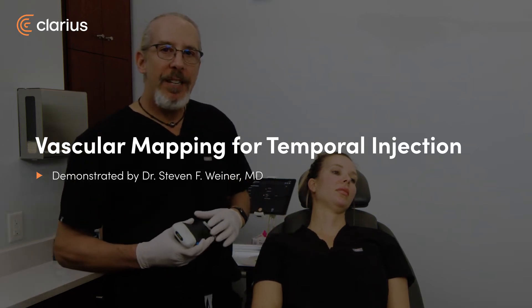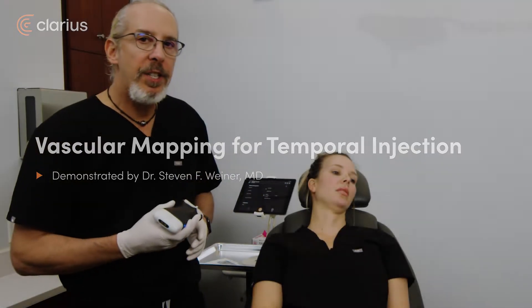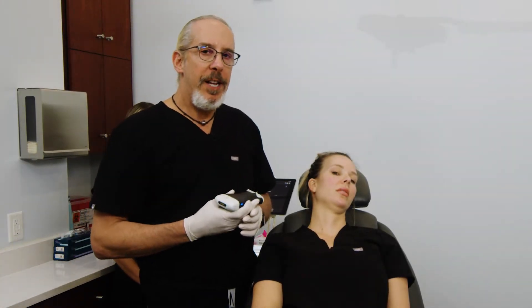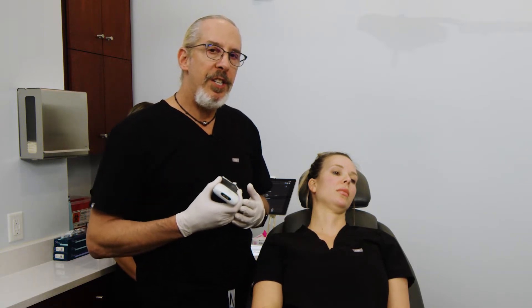Hello, I'm Dr. Steve Weiner, a facial plastic surgeon from Santa Rosa Beach, Florida. What I have here is a Clarius L20HD — this is the newest version of the Clarius. And what I'm going to show you is my ultrasound-assisted temporal injection.